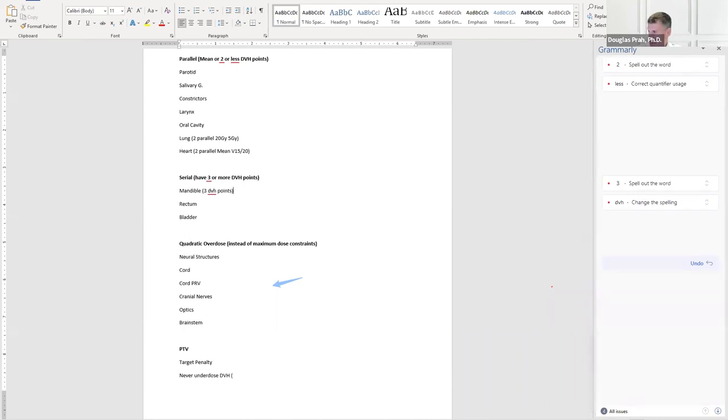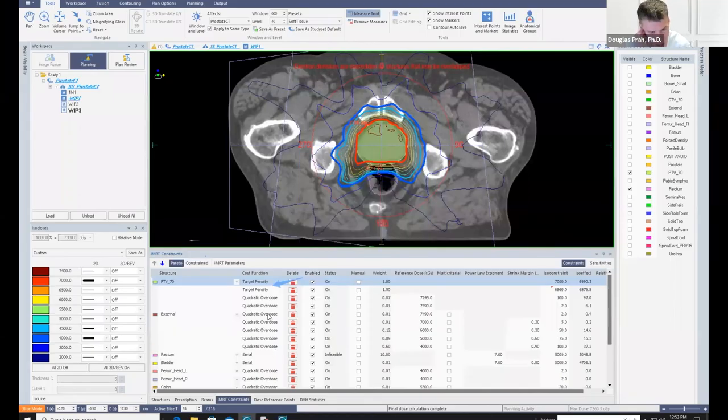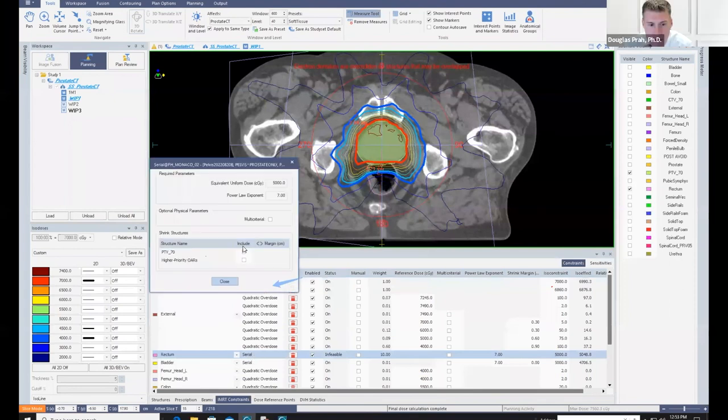Any other questions for those that have stuck it out? So Adi had another question about what CF do you use to control OAR dose and overlap between OAR and target? Okay, so if we go back to this one, I will use the shrink margin status. If I don't want to include the overlap, let's say the example is the parotid, right? The parotid often overlaps your PTV. So the optimizer does better if in that case you use a shrink margin on your PTV, but then make sure that you'll often use the parallel structure.